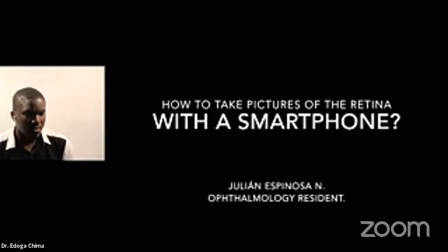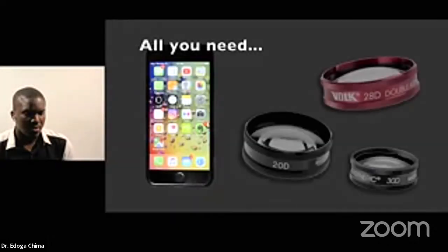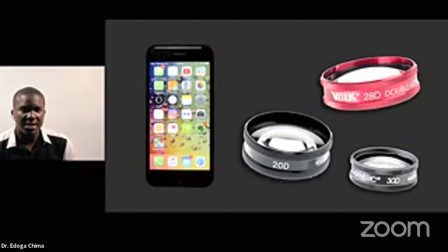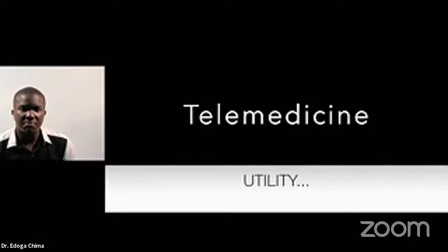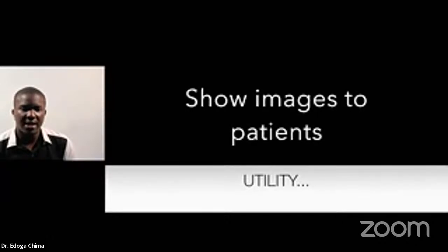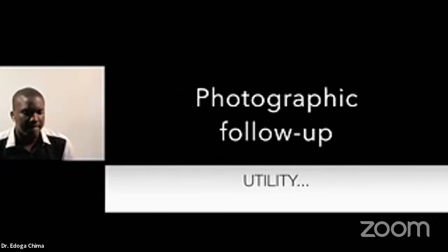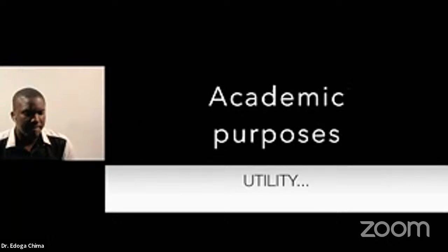This is a video tutorial on how to take pictures of the retina with a smartphone. All you need is a smartphone with a camera and a 20, 28, or 30 dioptric lens. If you can hear the video, please indicate by typing in the chat box. It is very useful to show the images to the patient, photographic follow-up of lesions, academic practices, and others.